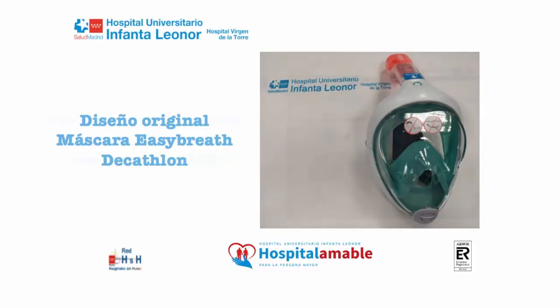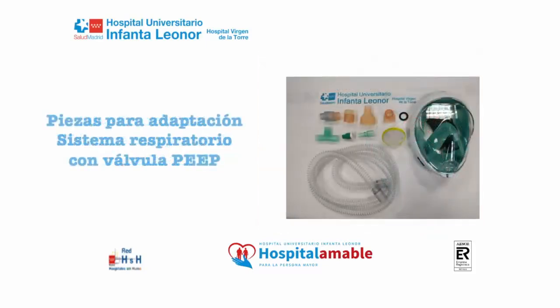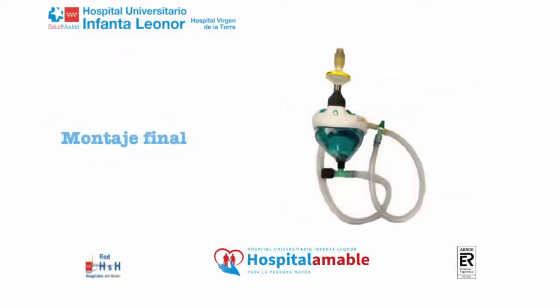Original Decathlon Easy Breath Mask. Parts of Respiratory System with Peep Valve Adaptation. Final Design.